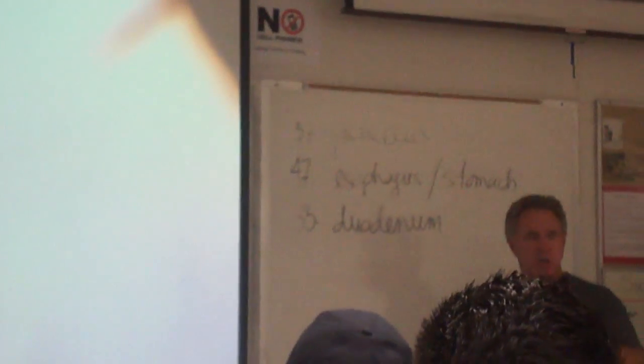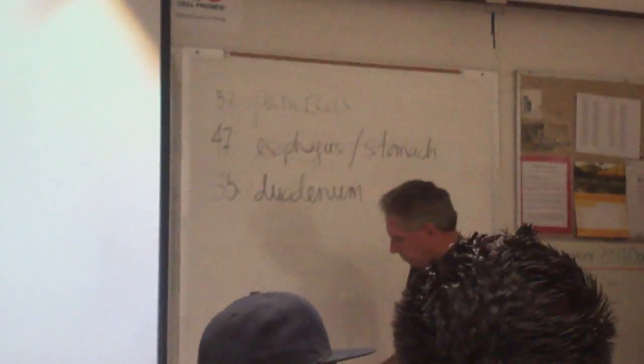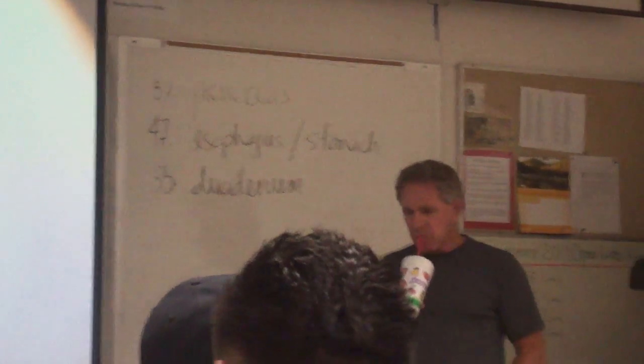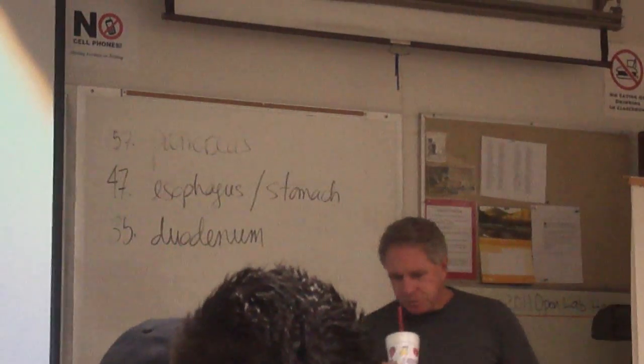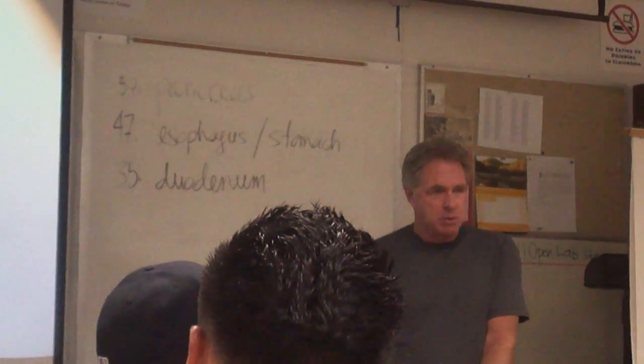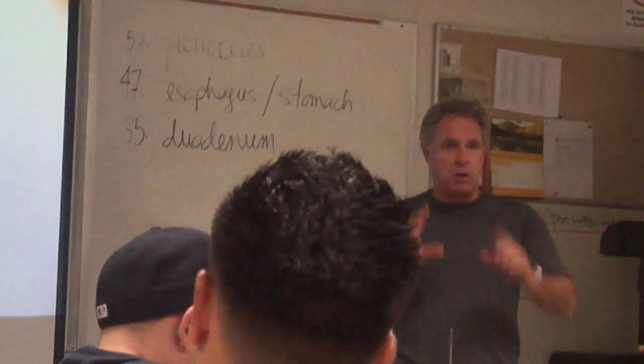Layers, like the mucosa and the submucosa. Mucosa, submucosa, all those layers. But we're also going to be looking for the duodenal glands, the Brunner's glands, the ones that say, oh yeah, this is the duodenum. So I'll show you what they look like. It should be a pretty good slide. Also, the muscularis externa, the circular longitudinal muscle, I can show you that too on the slide, I think.